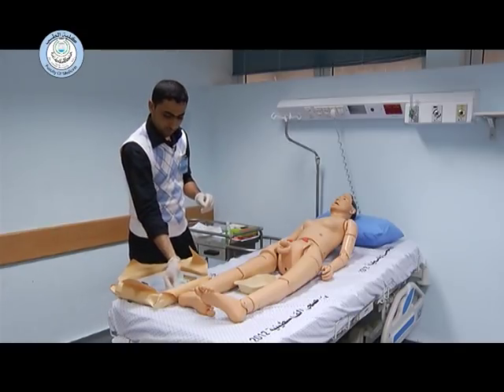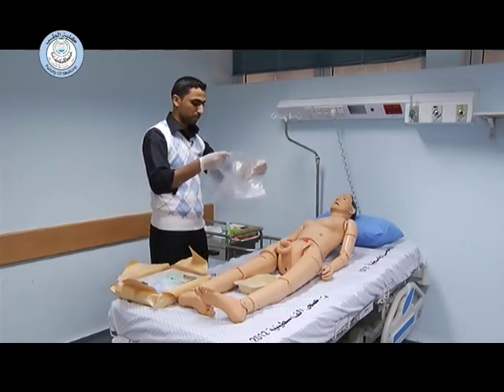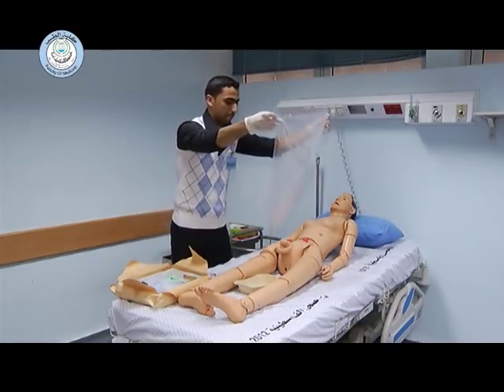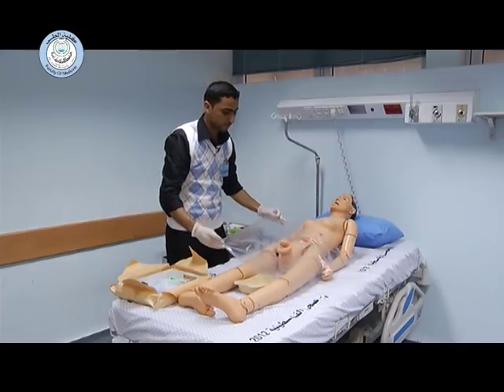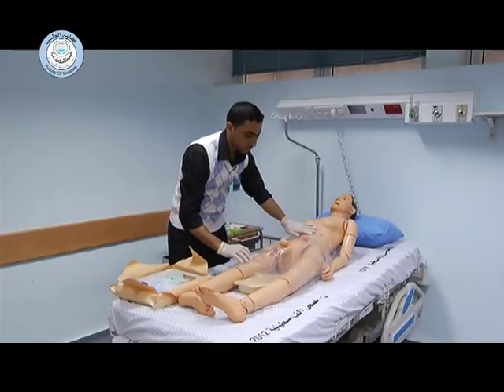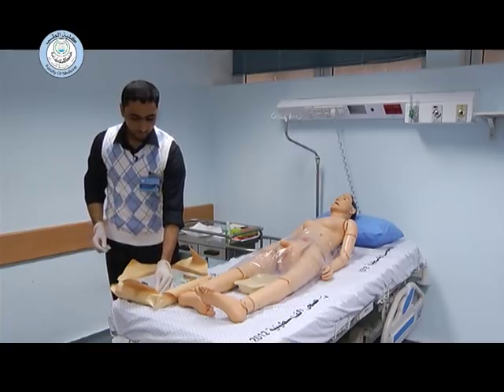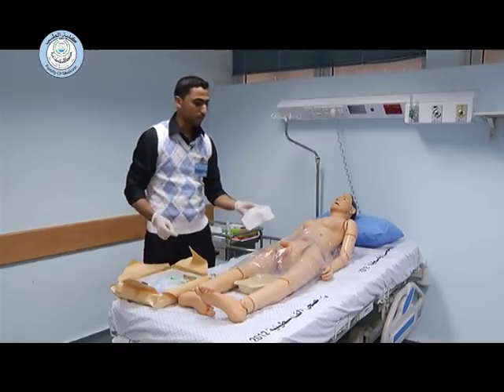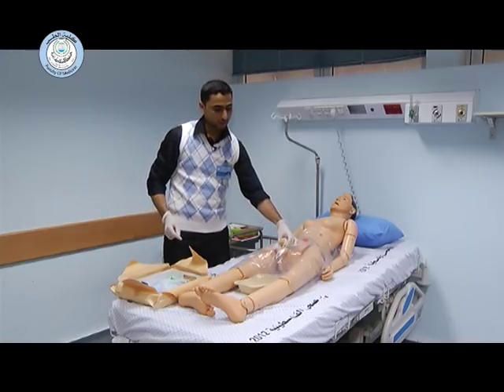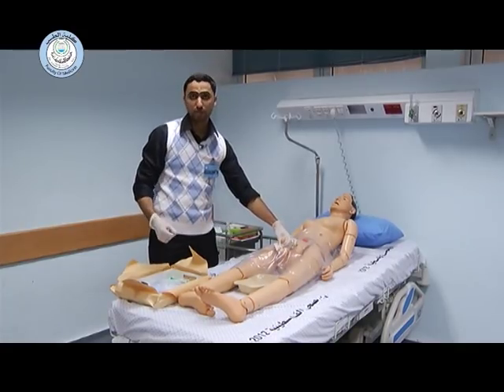Now we can apply the drape. This is the time to hold the penis with your non-dominant hand. The penis should be held in an upright position to make the process easier.